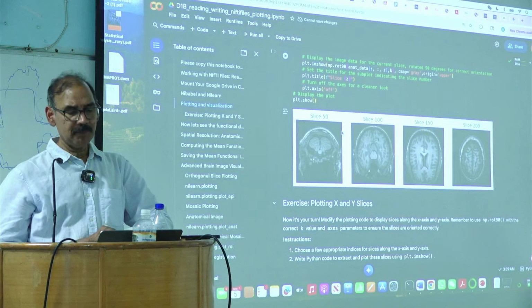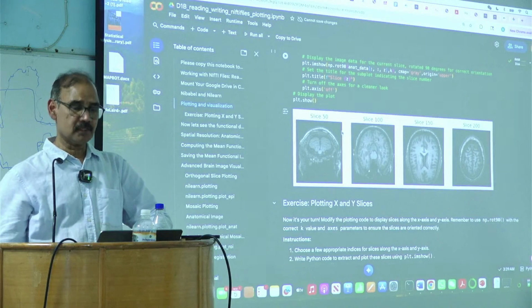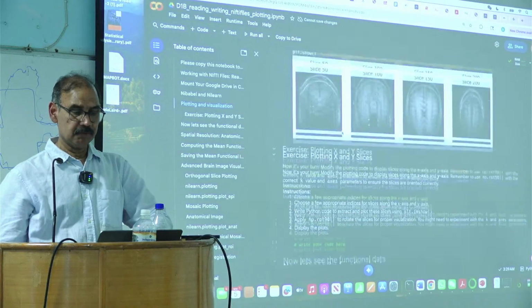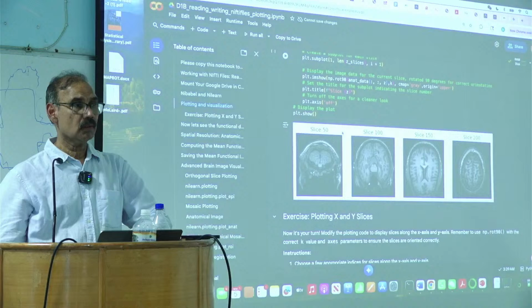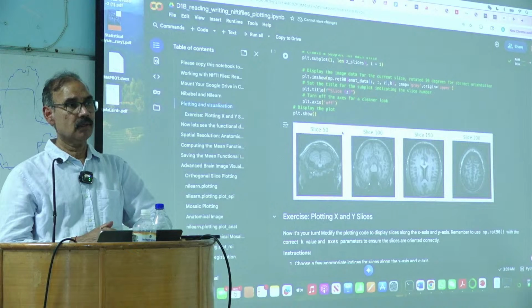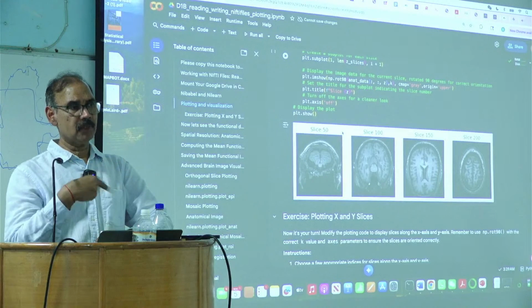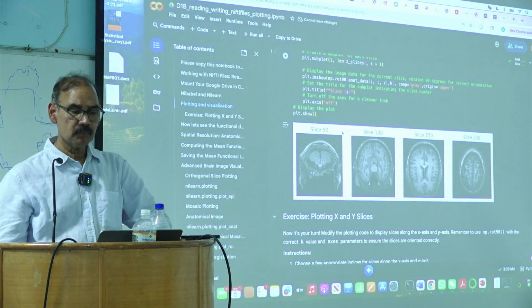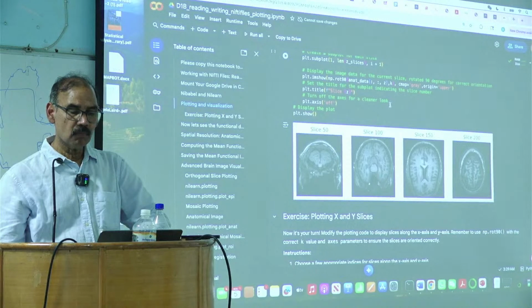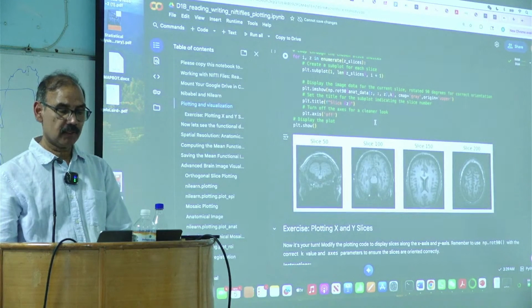Right, so sometimes we try to have an index, but I don't think it is necessary for this one. Right, so K is multiples of 90. Okay.